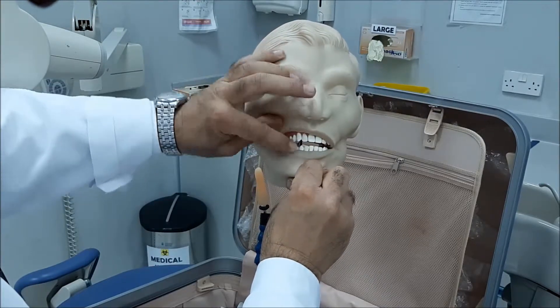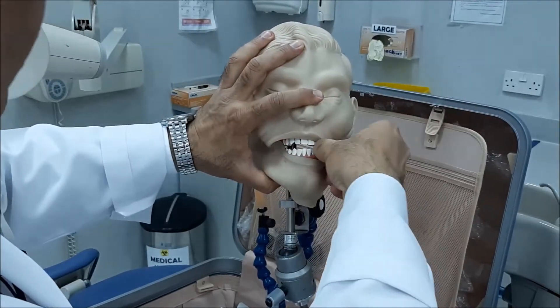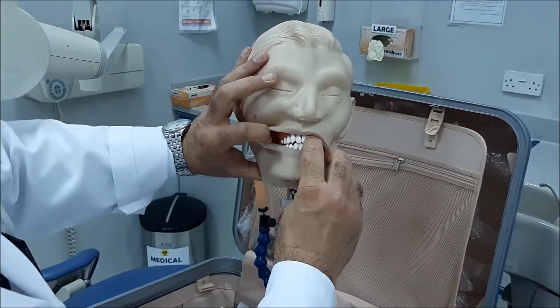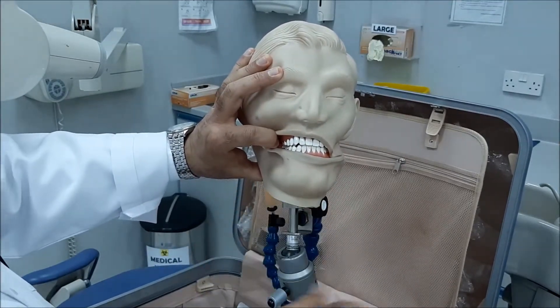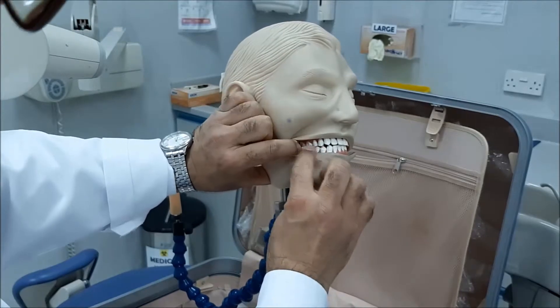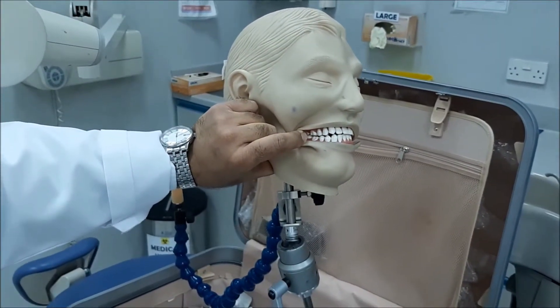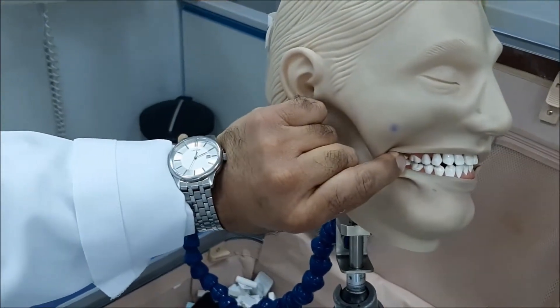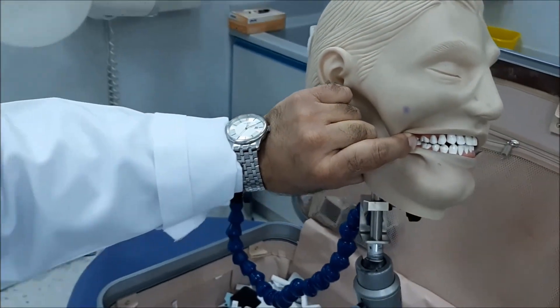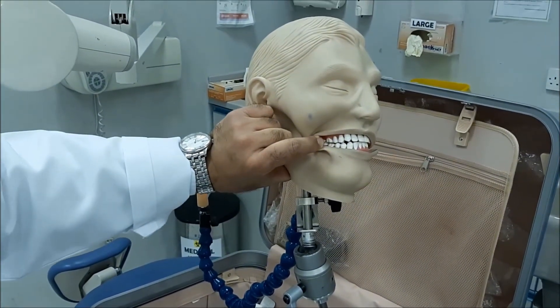This is the cheek, plastic cover. The patient is biting now. I will show you how it looks from here — only this small tab is shown, which is a bit difficult to notice, but again, we will try to utilize it in our placement of the cone.